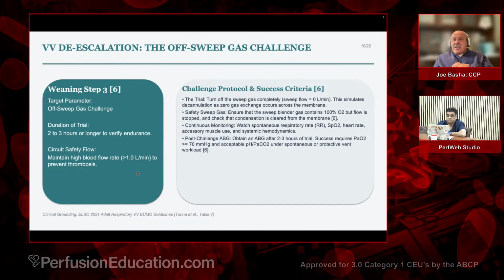Your VV de-escalation, the off-sweep challenge: at some point in time, you will reach a place where you are going to want to stop all support through the ECMO. The VV ECMO, without any gas going into it, I've said this now 3 times, so I guess it'll be the 4th time, is nothing more than a shunt. It's meaningless. All it is is a thrombogenic bucket of plastic and some fibers. So that's all it is, okay? It's not going to have any effect, but you have to turn the sweep to absolute 0.